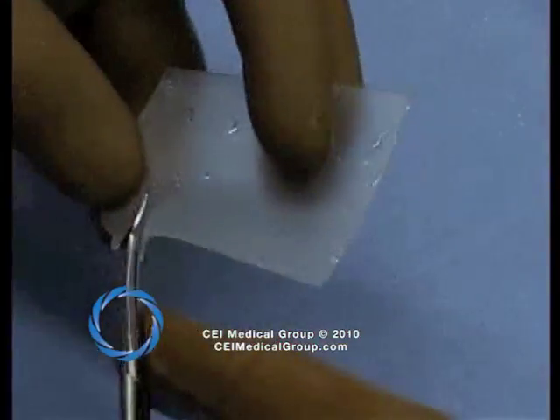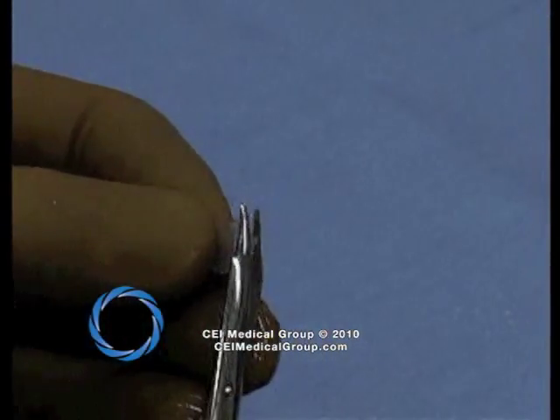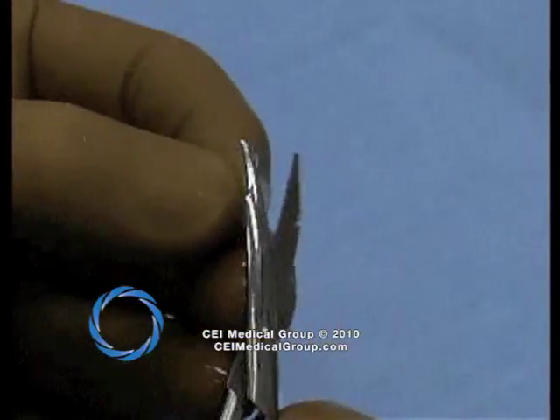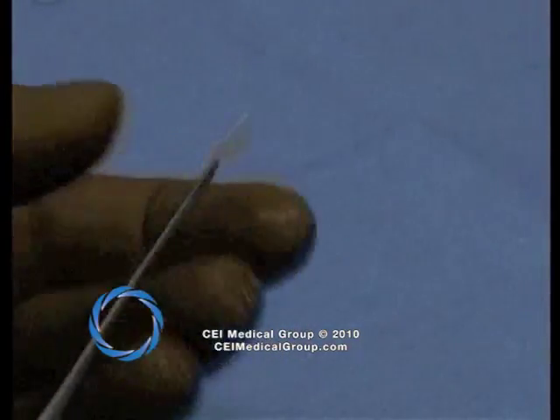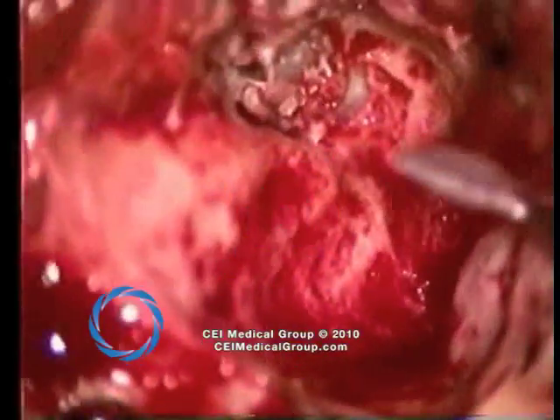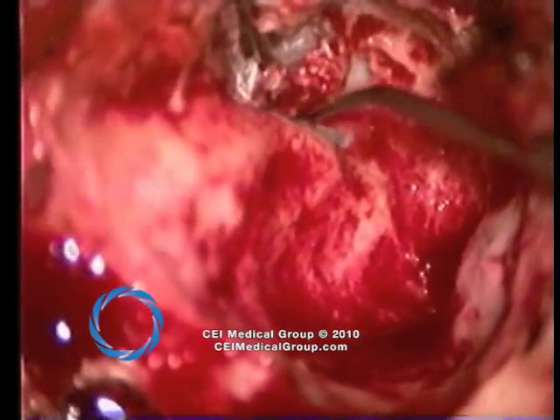Silastic, of a thickness of 0.020 inches, is trimmed and placed within the mesotympanum in anticipation of future transcanal ossicular reconstruction. The silastic is designed such that the entire mesotympanum and protympanum is filled. A small slip of silastic is created to fit in the eustachian tube orifice. Prior to mastoid reconstruction, the silastic is positioned deep to the remnant tympanic membrane in anticipation of reconstruction.